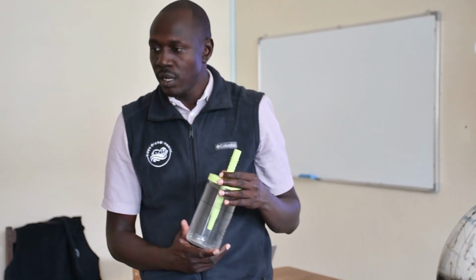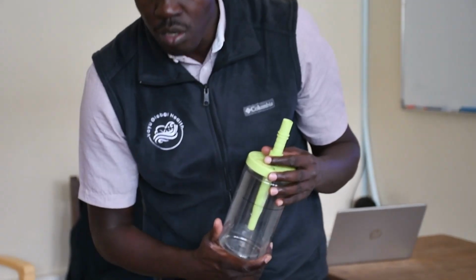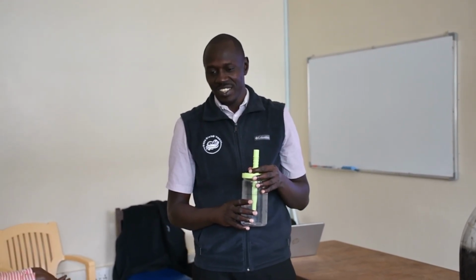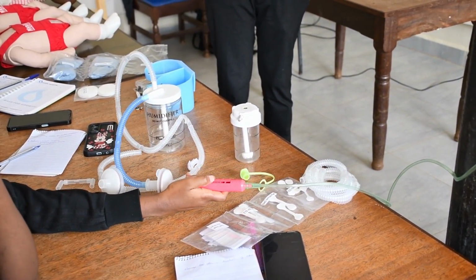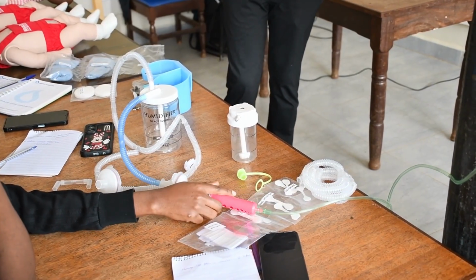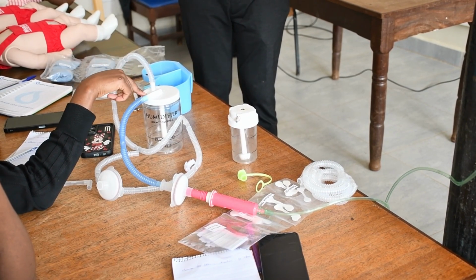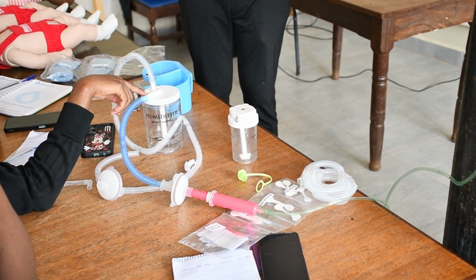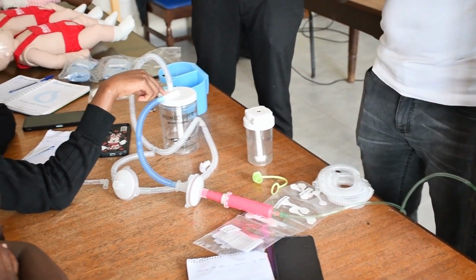Okay. So here you see that you apply high concentration, high pressure. That means you can give 10. No, 4 liters. Start with 4 liters per minute. And then here we have a leg, whereby you see we can give 6. That means there is a pressure that has been created up to this point. No, there is flow. So currently we are talking about flows. There's the flow of gases.